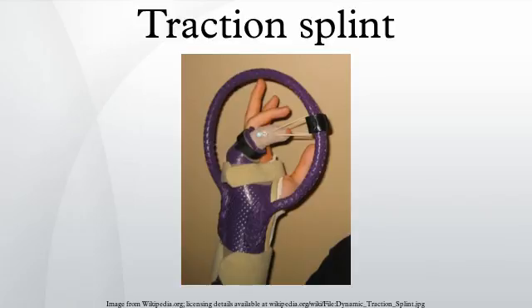The modified Thomas splint adapted the original Thomas splint to include a traction screw and footplate and limb support built into the splint body. The Hare traction splint is a further adaptation of the Thomas splint. Its length is adjustable via telescoping rods, and it has built-in straps to support the hip and leg at several points along its length. It also provides a more comfortable ankle strap and a small winch that makes it much easier to apply and adjust traction force.